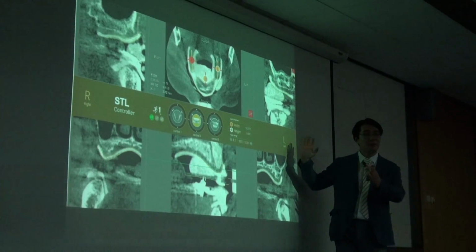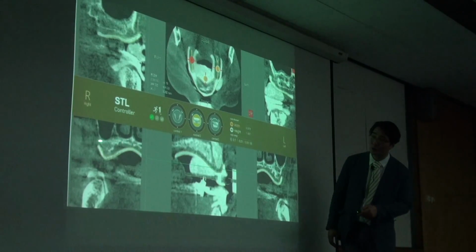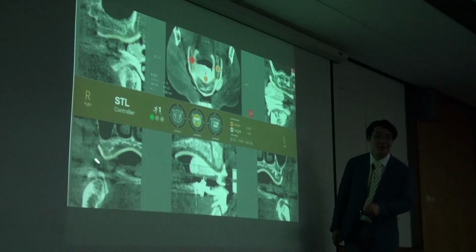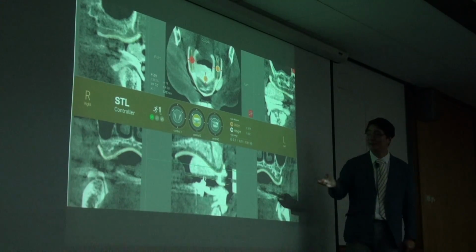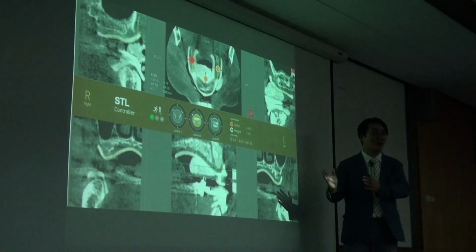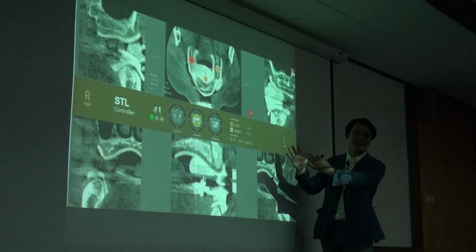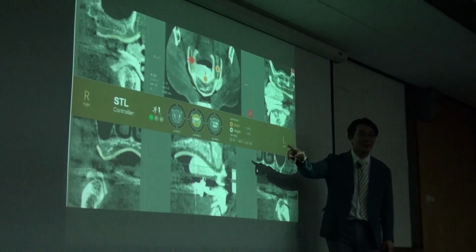We can control the image size. After I control the CBCT image size, it looks like a good matching condition. But I cannot tell whether this correction of the image is the right way or the wrong way. But anyway, using the control of the image size, we can match the STL and CBCT perfectly.